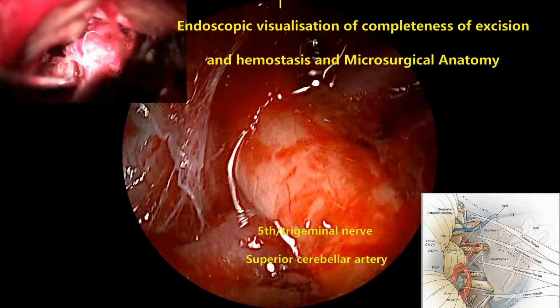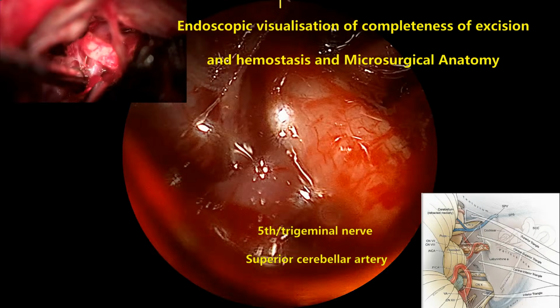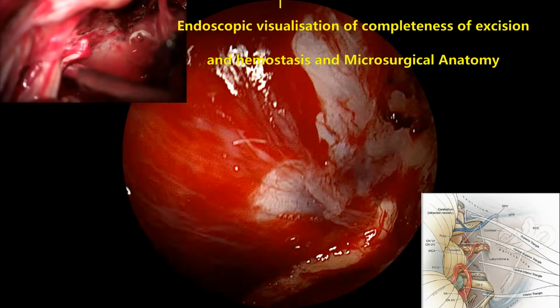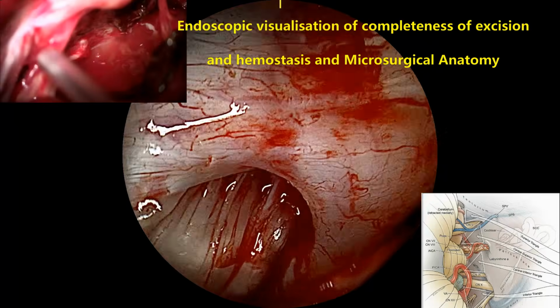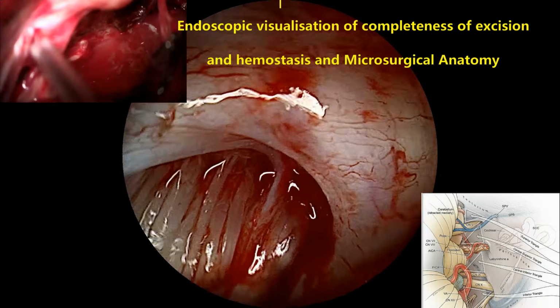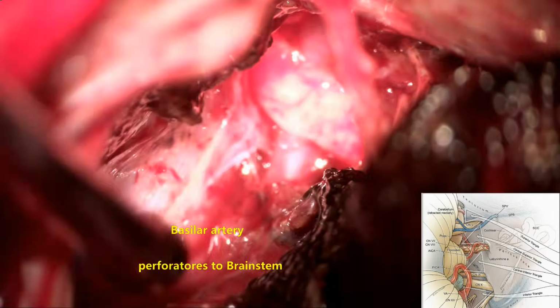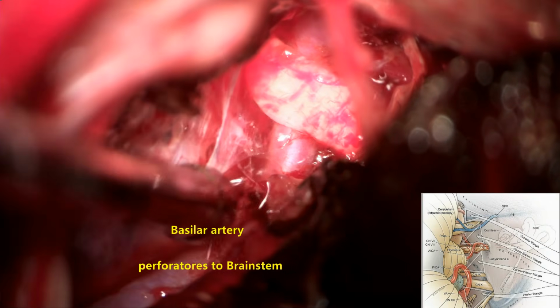All the cranial nerves, 4th, 5th, 6th, 7th, 8th, 9th, 10th, and 11th, are very well preserved. Vessels are very well preserved. That's the 6th nerve. The 7th, 8th complex is getting into the internal auditory meatus. That's the jugular bulb or jugular foramen, with the 9th, 10th, and 11th cranial nerves entering there. Absolute hemostasis is achieved. You can see the end stage of surgery.